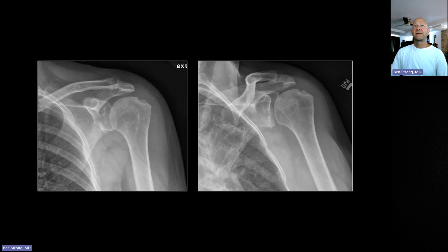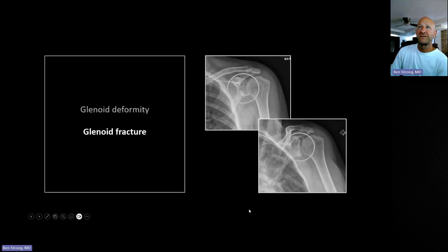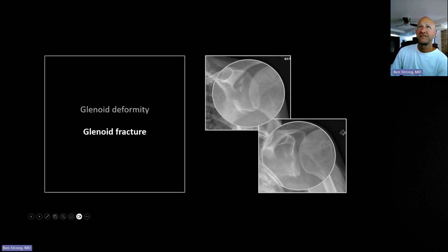This is a glenoid fracture and it's a pretty subtle one. You can actually see there's a step off here and it looks almost like there are two glenoid surfaces, with a little redundancy. This is basically just an impaction fracture of the glenoid — it's been pressed in — and that's why you can see that overlap here inferiorly and medially. So glenoid as well as scapular fractures can be pretty subtle.